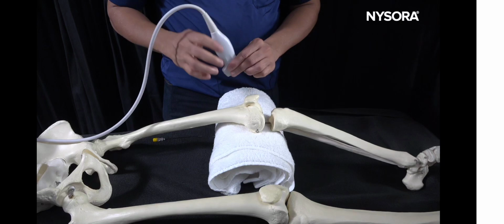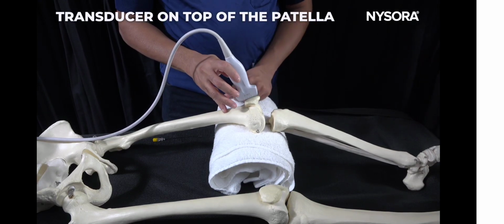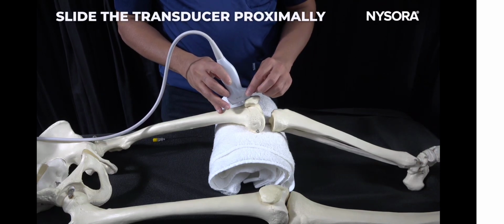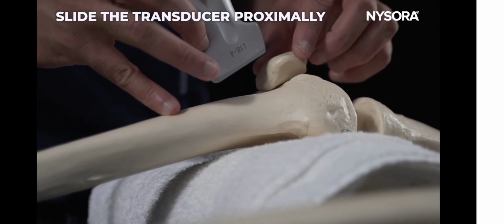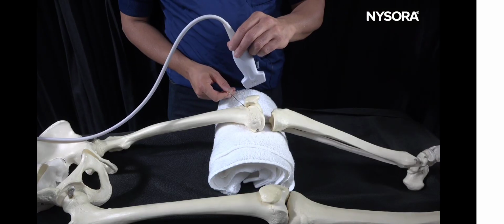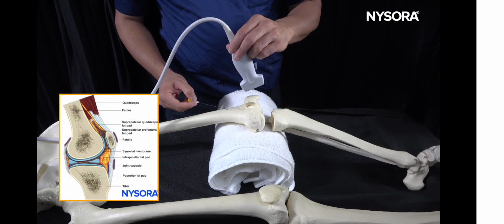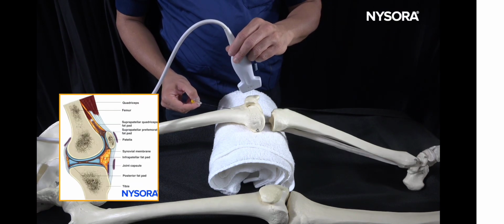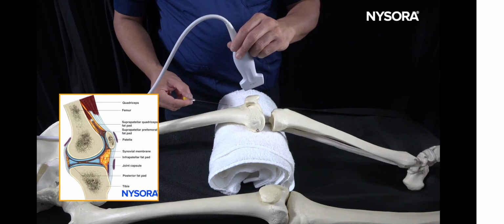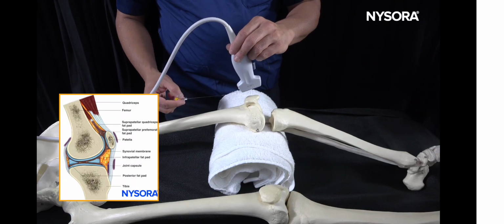Start by feeling for the patella and placing the ultrasound probe on the top of the patella, and then keep moving the probe proximally. Here you will be able to see quite a lot of structures. On the top of the patella, the soft tissue structure will be the suprapatellar fat pad. In front of the femur, another fat pad is located. That's a prefemoral fat pad. And between the two fat pads, you'll be able to see the outpouching of the suprapatellar recess.